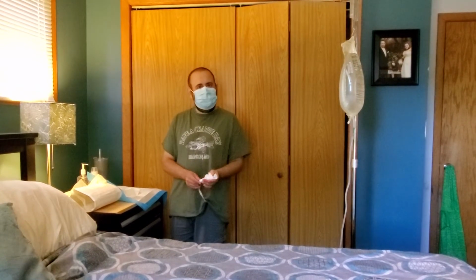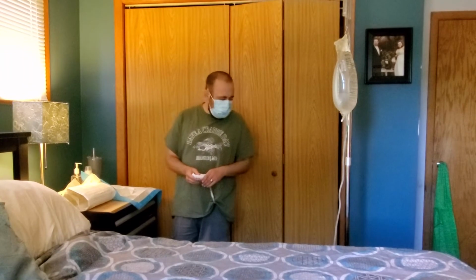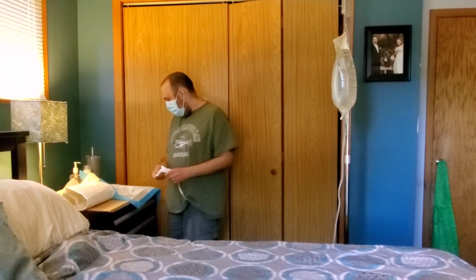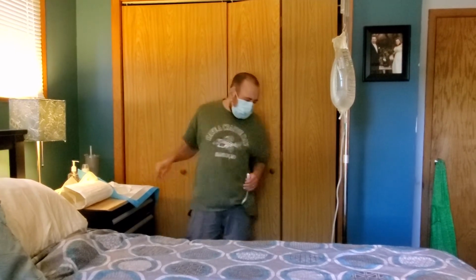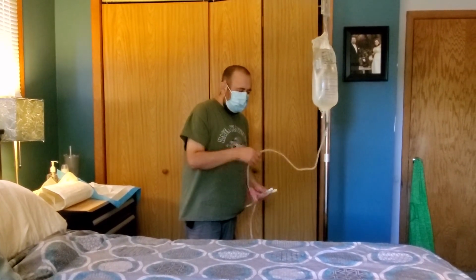You know how long I've been cleaning this? I would say probably about a minute. Okay. So now that this is clean, I'm gonna get the fill and drain lines ready.